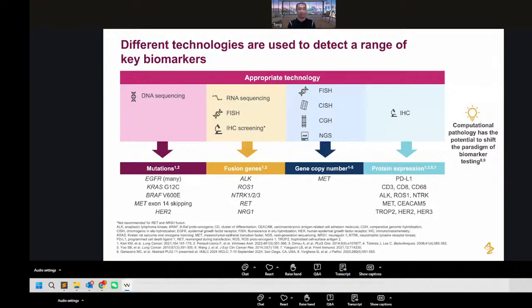Different targets demand different tools, so we have several different technologies focusing on different areas. DNA and RNA sequencing detect mutations and fusions, especially RNA sequencing, which can detect fusions. NGS, next-generation sequencing, consolidates this into broader, more comprehensive panels that can address multiple actionable genes. FISH or ISH can detect fusions, and CGH can expand to genome-wide analysis, right?